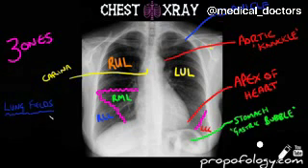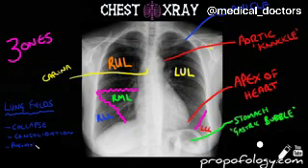We're going to be doing more videos on certain pathologies you can see on chest x-rays, because whenever you're looking at the lung fields, you should consider whether there are certain things within them. You should consider, is there any consolidation in any of the lobes that we've talked about? Is there any collapse of those lobes? Is there any pneumothorax, so is there air in the pleural cavity surrounding the lungs, such that the lung fields don't quite go to the end?